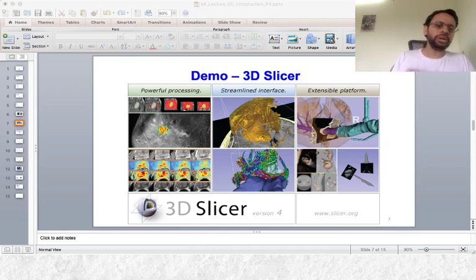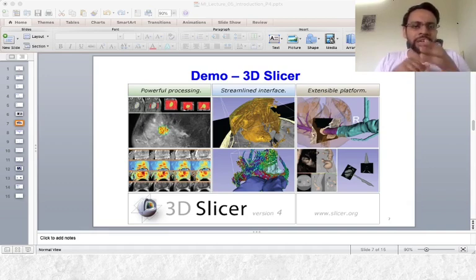And another tool, maybe this is a bit more specific tool, this is referred to as SPM tool, available in MATLAB, statistical parametric mapping. Particularly for functional MR imaging, this is widely used.